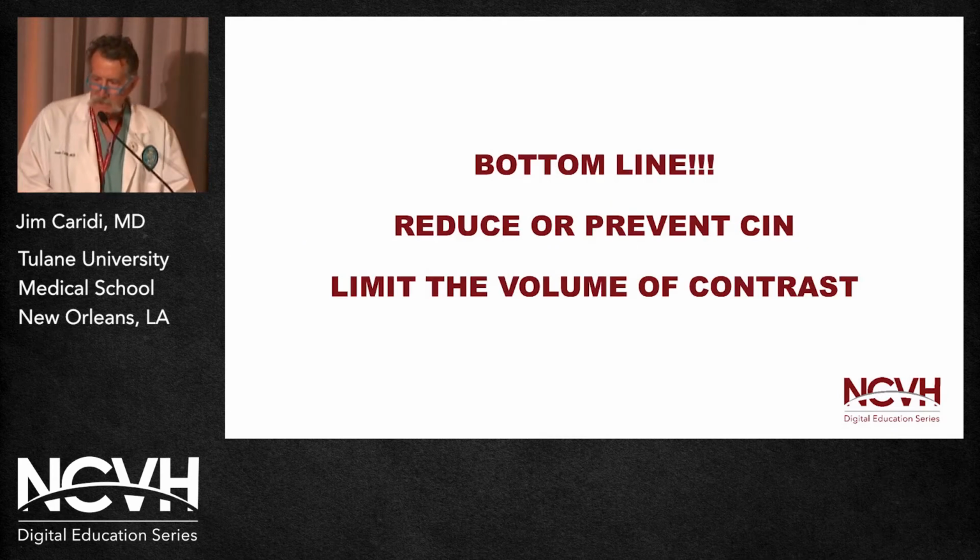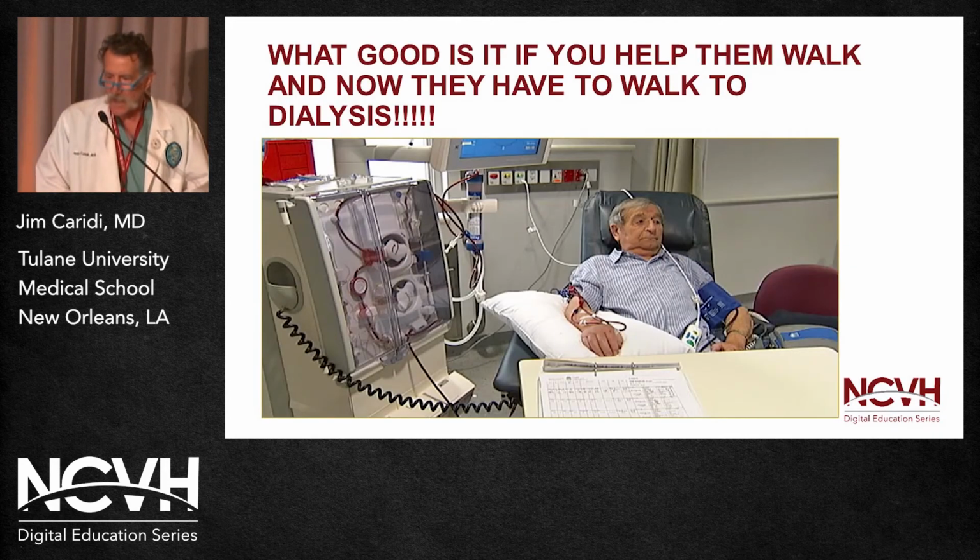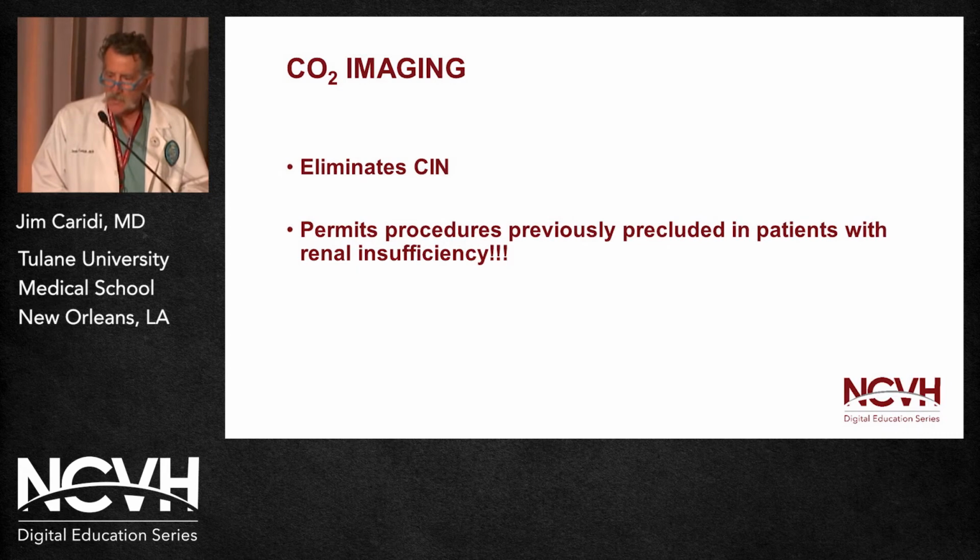The bottom line to reduce or prevent contrast-induced nephropathy, which is very costly, is to limit the volume of contrast. And this is what we say at Tulane: what good is it if you help them walk and now they have to walk to dialysis. So CO2 imaging not only eliminates contrast-induced nephropathy, and if you listen to Craig Walker, he'll tell you the same thing, it permits procedures on those patients that were previously precluded from having the procedures done.